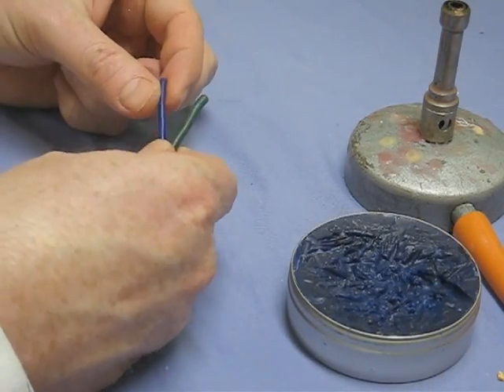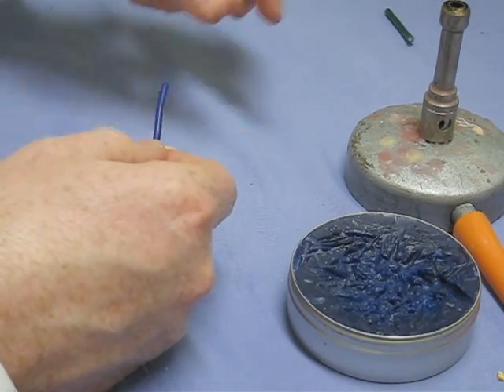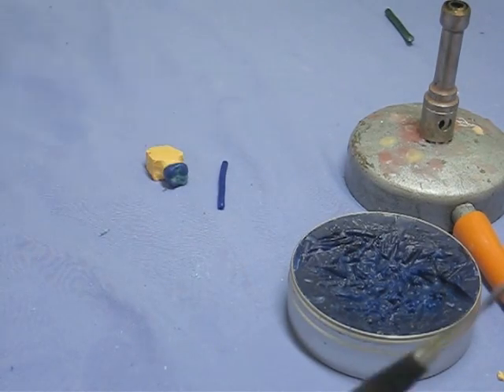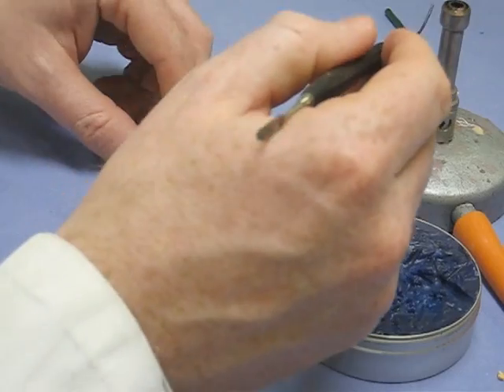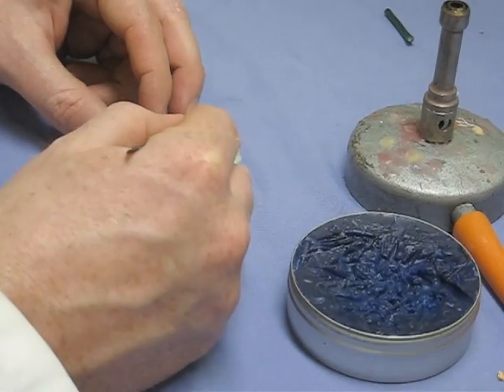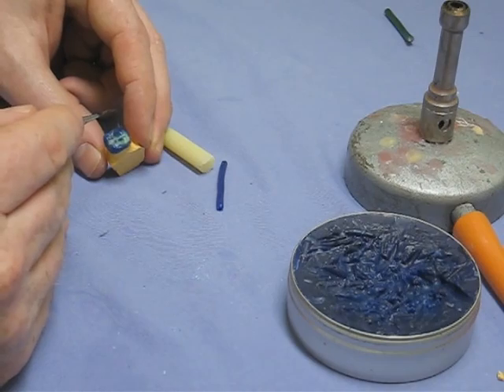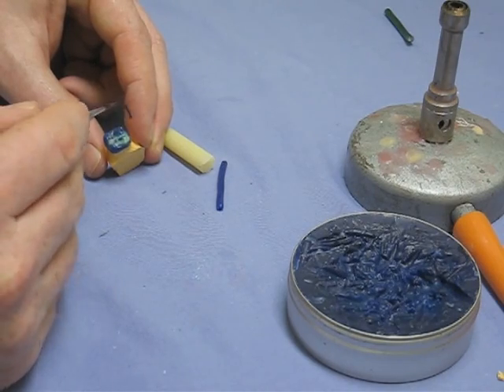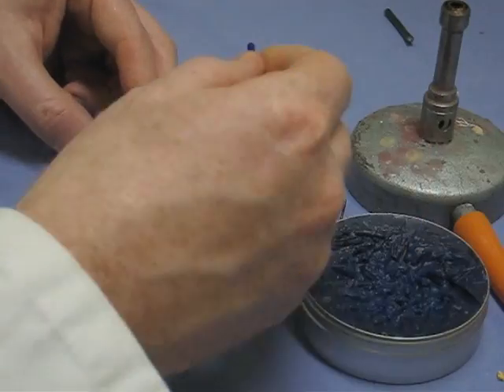A couple of spruing waxes here just to show you the different sizes. With the gold we can use the thin spruing wax because it flows readily. We're going to use a little bit of sticky wax just on one of the cusps to stick the spruing wax to.